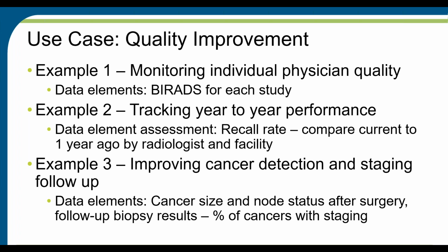We use this data to monitor the overall progress of our radiologists, helping us determine who needs that refresher course. This assures that we are keeping our mammography program as current as possible, and it provides our patients with the best possible service that we can give.